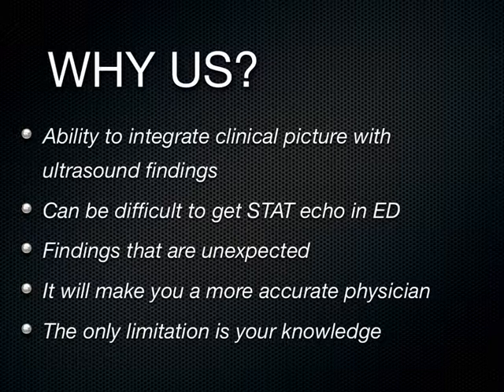So this was an undifferentiated patient. The medical student just happened to be scanning, going bed to bed, and picked that up 2 days ago. Would that have been discovered with a thorough history and physical? Maybe, maybe not.